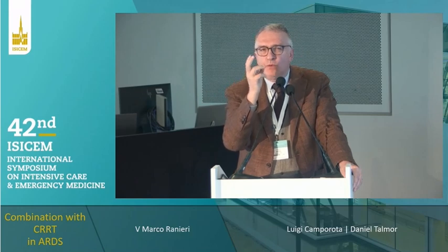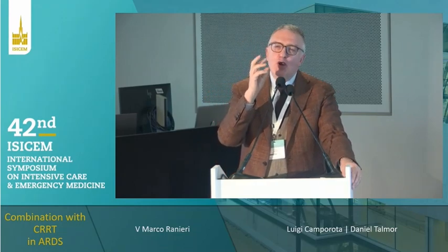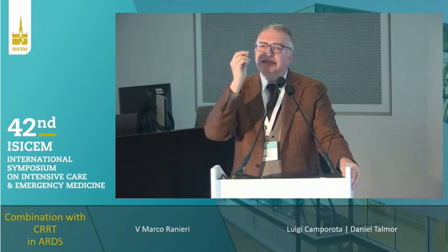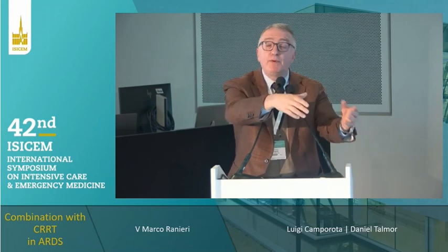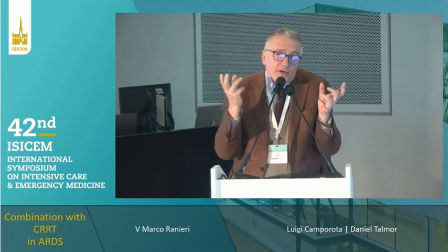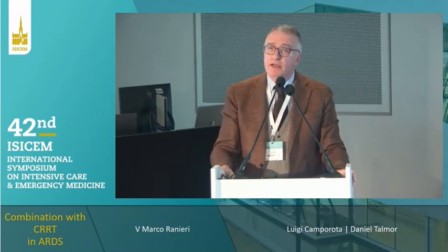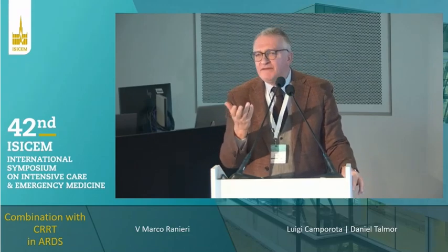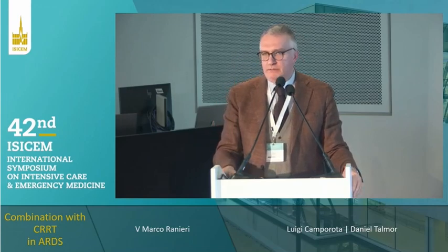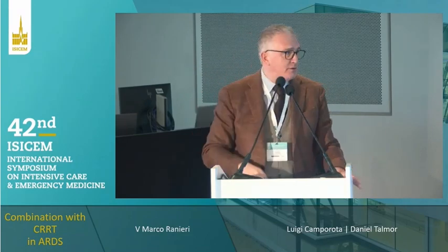And the other thing we have to understand is that at a conference recently, somebody said, God does not make all low blood flows equal. So it's not the blood flow in itself. For example, in this context, the relative position of the oxygenator and hemofilter makes a difference. A small difference, but it can be substantial given the limited range of blood flow. So I think we have enough data to start to consider clinical trials. We don't need only randomized controlled trials. We can do something else, but that's another story.